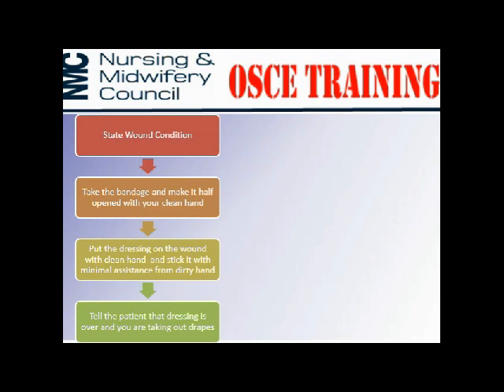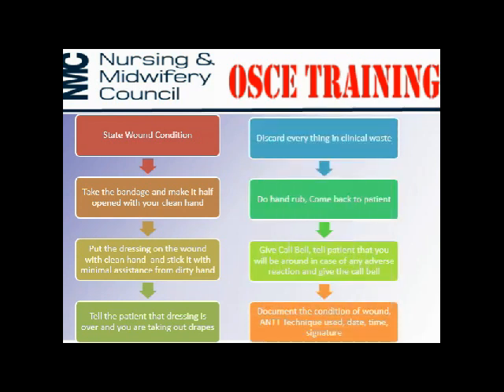After cleaning the wound, you need to state the wound condition. If it is a surgical wound, you should tell the examiner that the wound is clean and the sutures are intact. Then you need to take the bandage which you have already opened in the dressing set with your clean hand and make it half opened with your clean hand. Then you need to put the dressing on the wound with your clean hand and stick it with minimal assistance from the dirty hand.